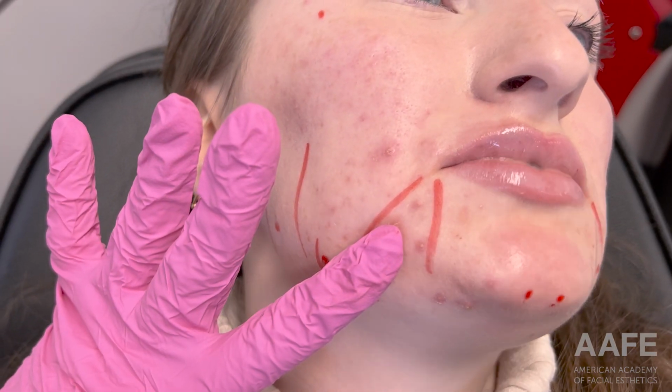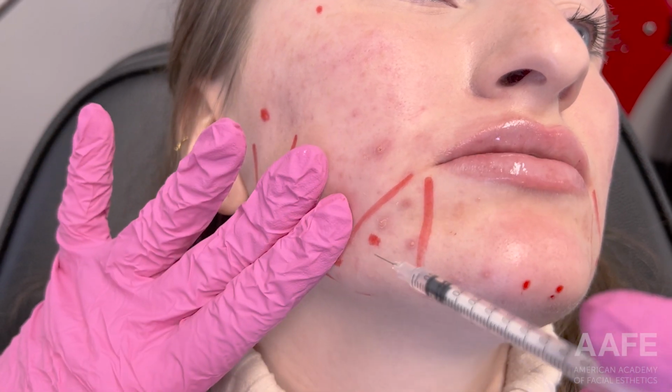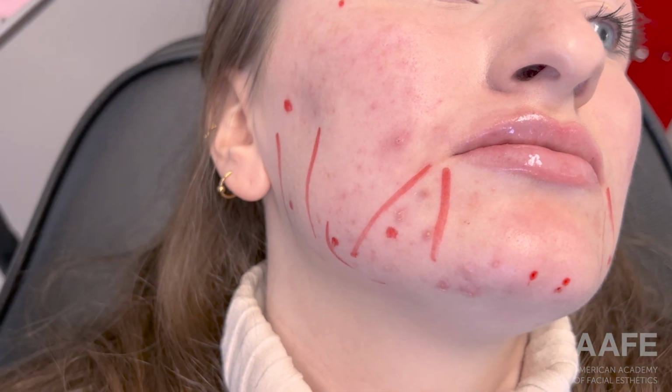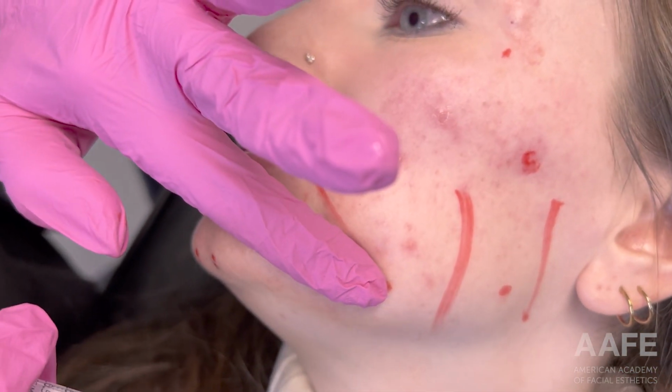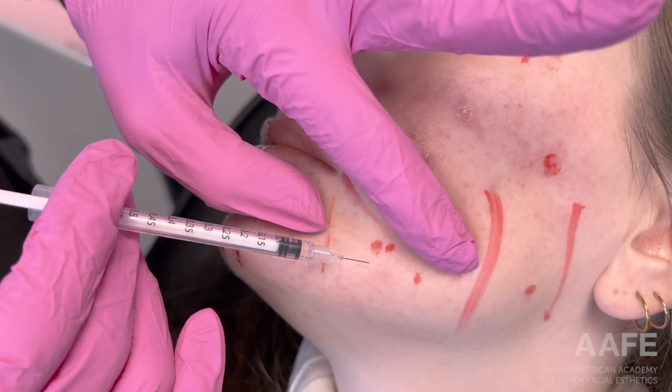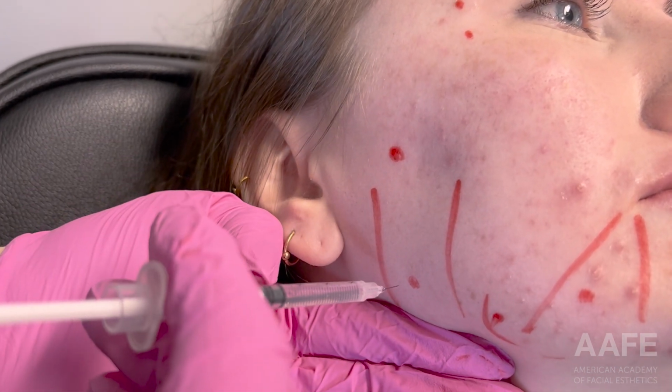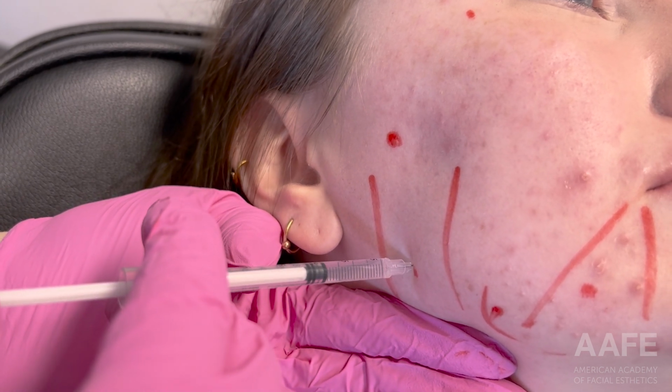Mentalis, I'm isolating that muscle and going straight in, right into the belly of that. And then DAO, I always feel the muscle pull. So I have them animate and I actually feel the muscle movement because that is what we are treating. I inject away. We always want to avoid DLI if we can, so that we don't affect the patient's smile. I want to stay a little bit more laterally.